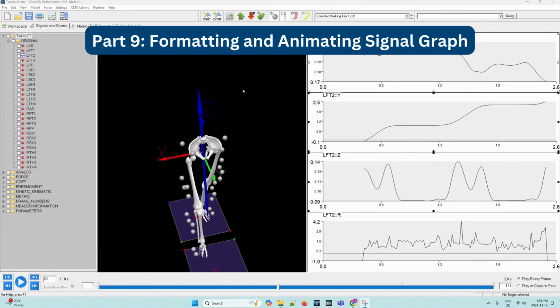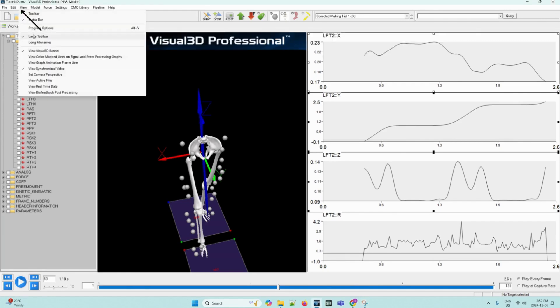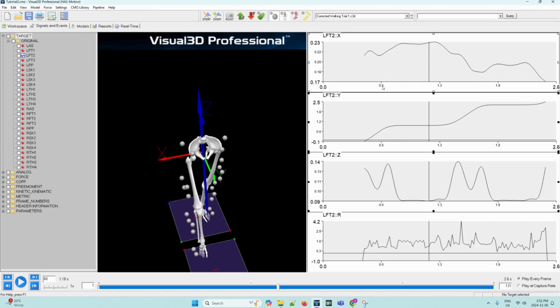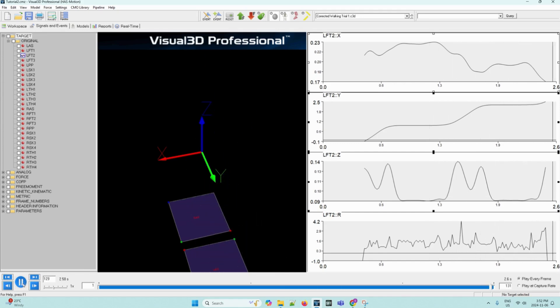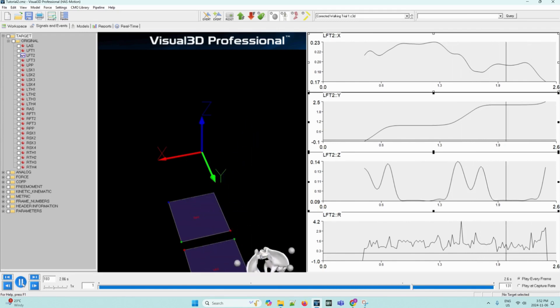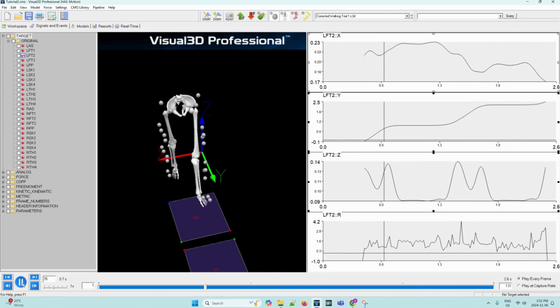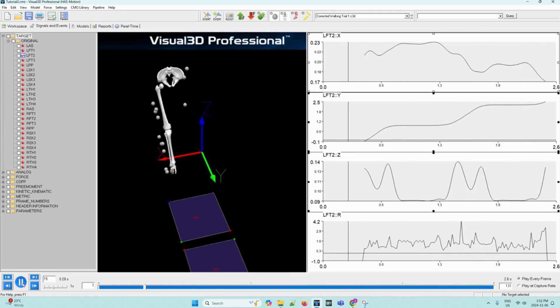Now that we have learned how to display a signal graph, we can learn how to format and animate it. From the view menu, we can click on view graph animation frame line and this will create a line on the graphs that will correspond to a point in the animation. We can then click play on the VCR control panel to activate the animation. As you can see, the vertical line on the signal graphs will move along with a 3D figure.